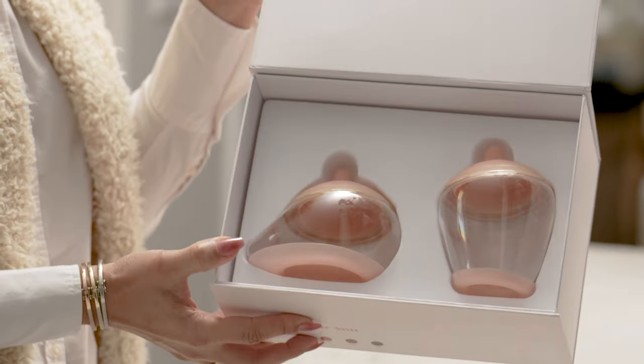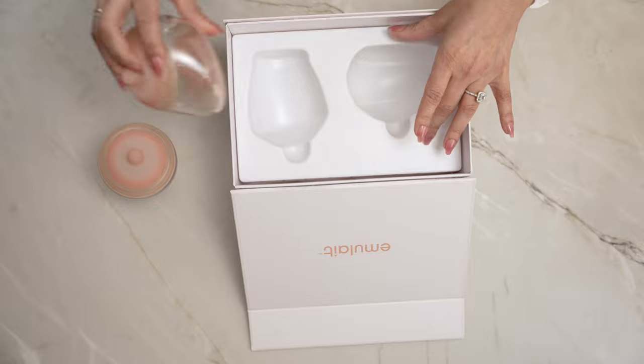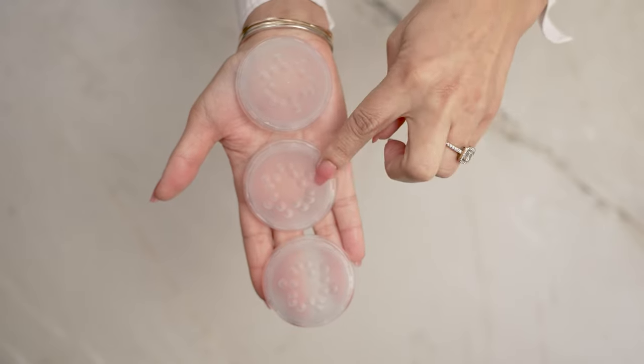Hi, my name is Alexis and I'm going to do a brief tutorial on how to use your brand new Emulait bottle. The Emulait bottle must be used with a flow control inside the nipple. Lift the tray to find your slow, medium, and fast valves.